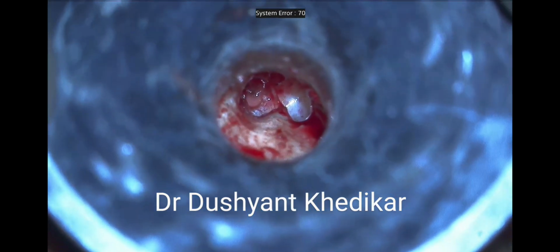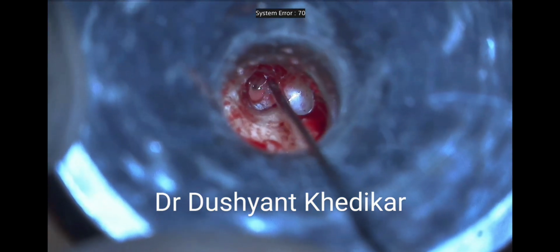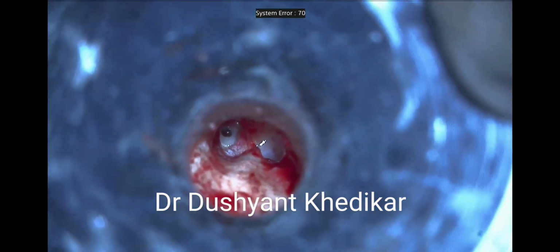The bony fenestra is now enlarged to a desired size. Suctioning is prevented directly over the fenestra so as to avoid the iatrogenic sensorineural hearing loss in the postoperative period.